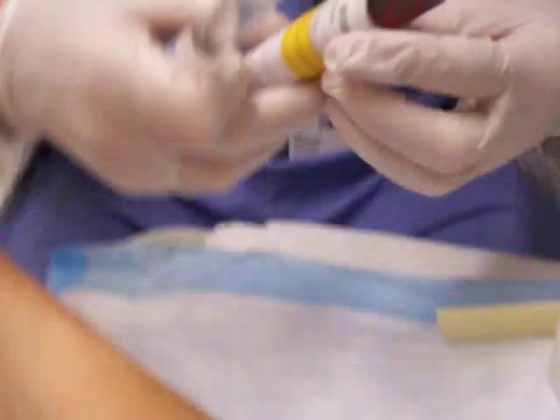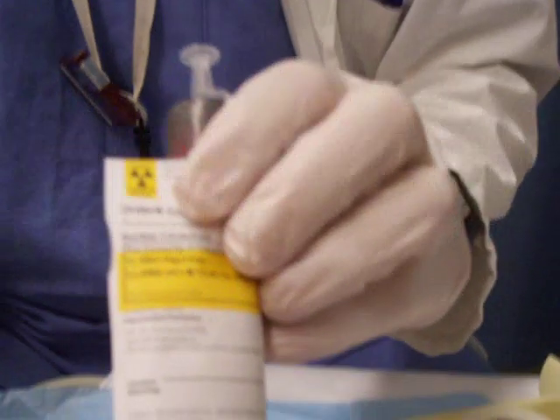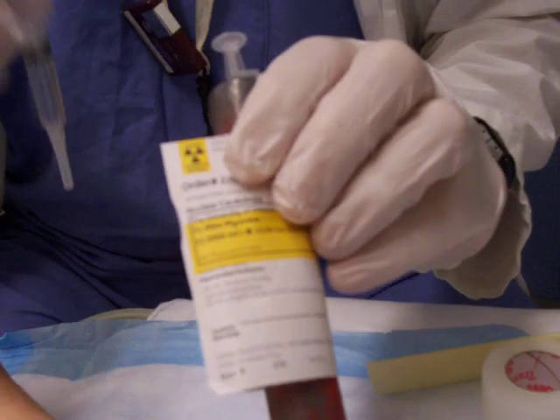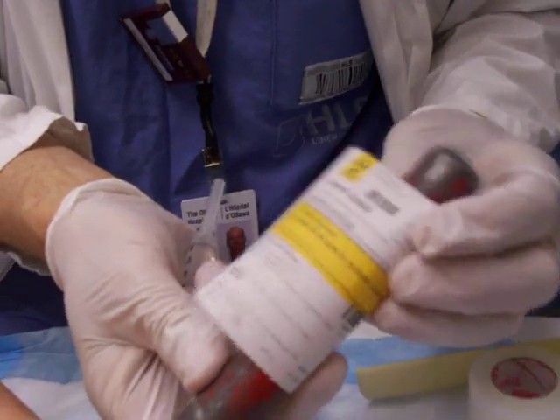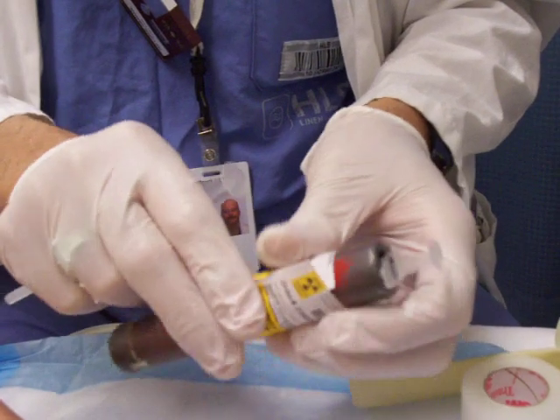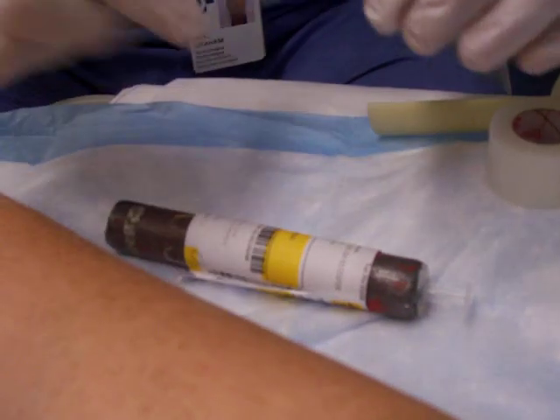He's back with the radiation stuff. This is what it looks like here. You can see the little symbol here just in the corner, which tells us that that's radioactive material, and it's in just a little lead pot. Because as a nuclear medicine technologist, I've been in nuclear medicine now almost 26 years.